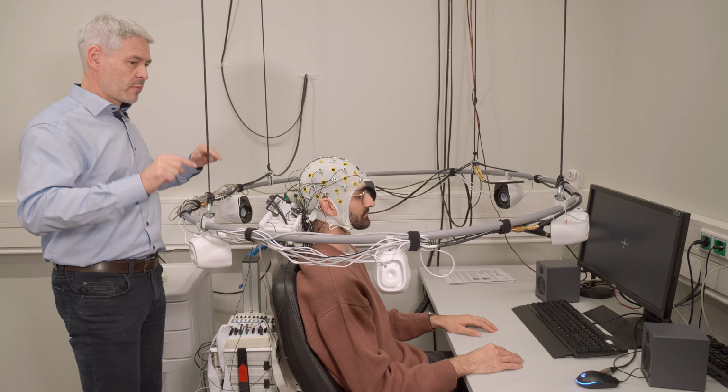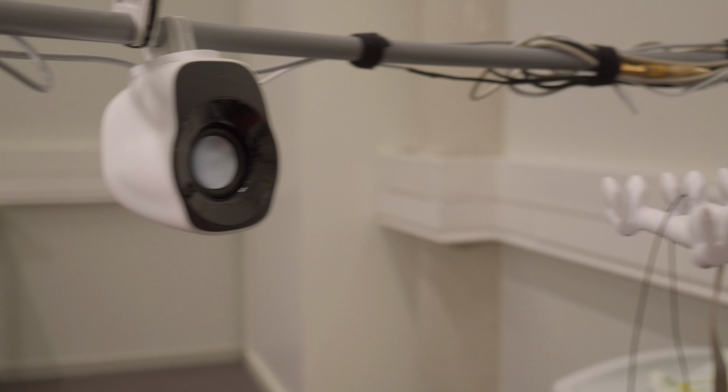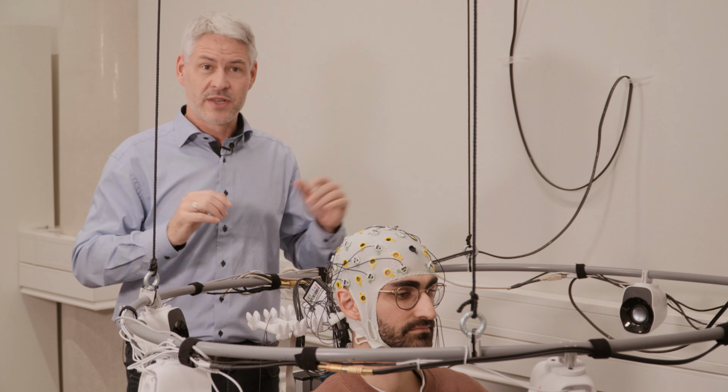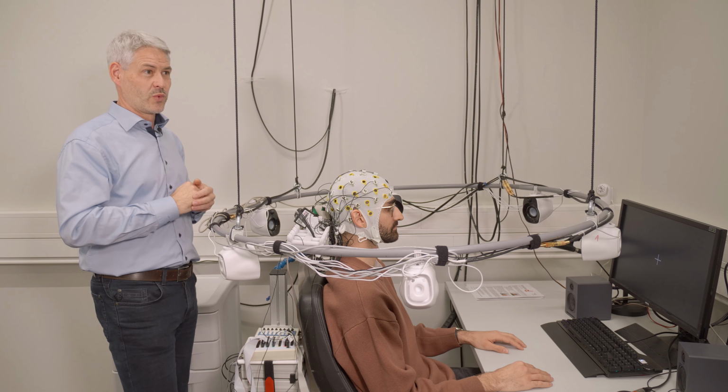loudspeakers. We are playing a lot of words from those loudspeakers while the patient needs to pay attention to only one of them. We see difference in brain activity if a patient manages to listen to the target word and ignore the other words, compared to playing any of the non-important words.